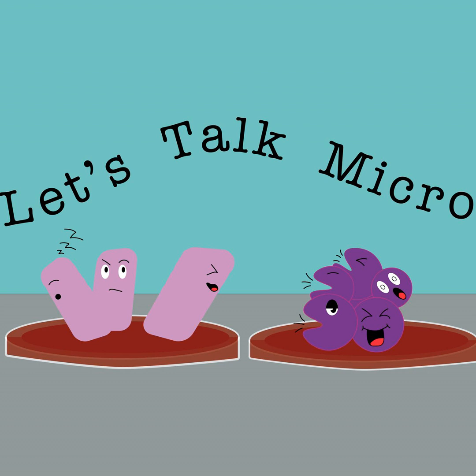Yeah, definitely. And you get lucky if they morphologically are a little bit different, and that's why we want to pick those and work them up. But sometimes we probably miss them on something like a wound or a respiratory, because if they're not morphologically different, there's no way you would know. So there are probably some undetected populations in there that, as we do a little bit more genotypic testing, we might start finding and having to deal with in the clinical lab a little bit differently than before when we were doing phenotypic only.